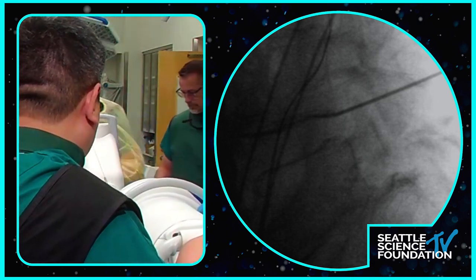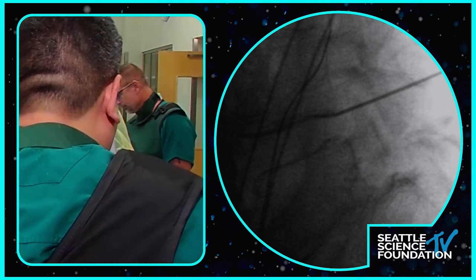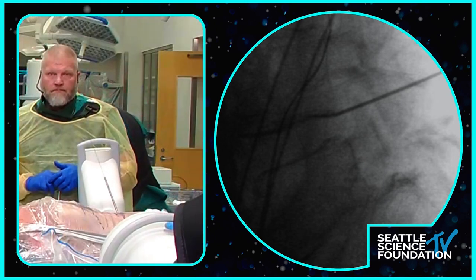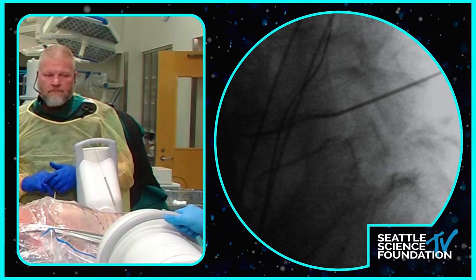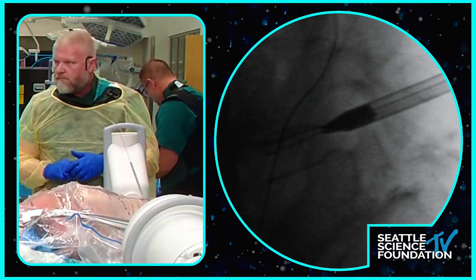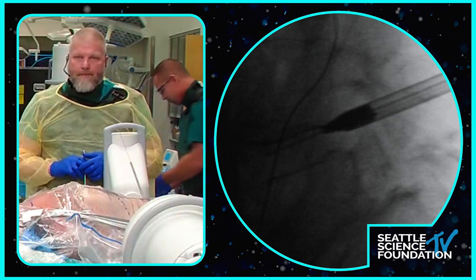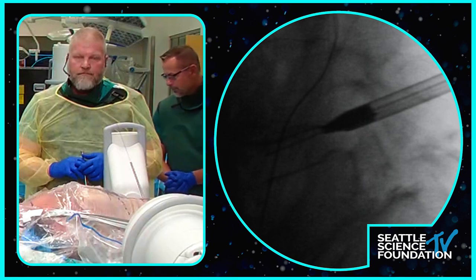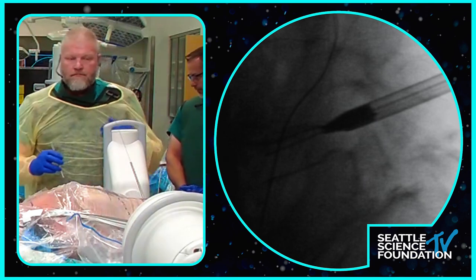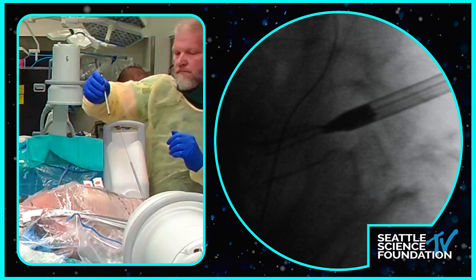I think it's an important point to mention that Ray really relies on the MRI, because a lot of questions we could ask is, how do you plan your trajectory? Honestly, I used to make these lines, but I almost always use the MRI, the axial cuts. I don't know about anyone else here who does. What about you? Well, a lot of people do 45 degrees, so it's just the middle of the disc laterally and the same on the dorsal surface. I typically do 2/3 in the back, so I like to be a little bit steeper.